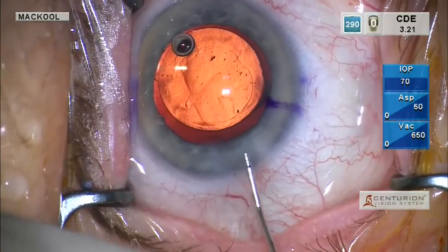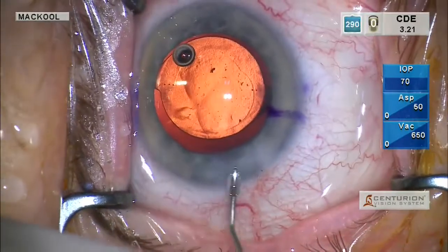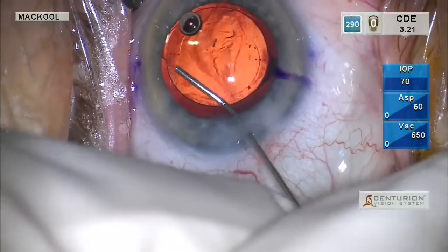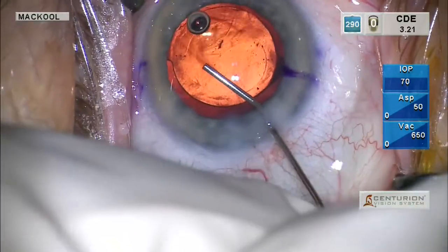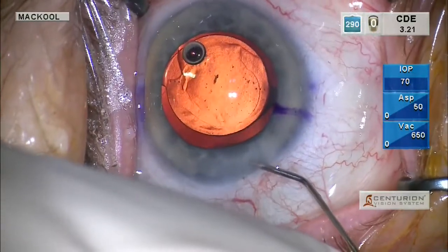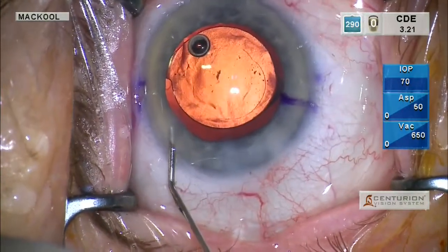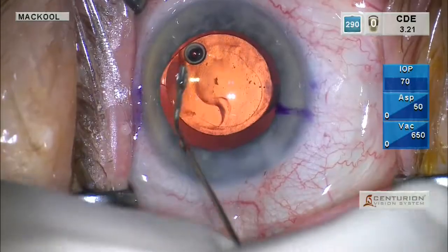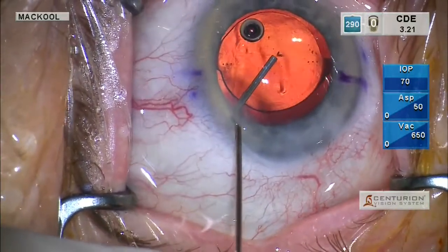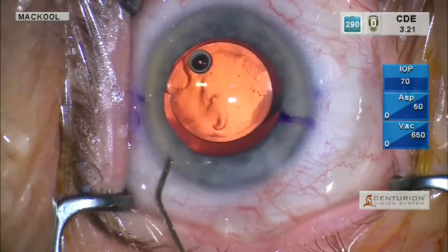And now I'm going to perform stromal hydration. Irrigate a little bit out by the chamber angle to make sure there are no nuclear particles. But you can tell that there's OVD in the chamber. You can see these little microscopic particles in the center of the eye. That one there I might aspirate, like so. But you can see that there's still viscoat there.